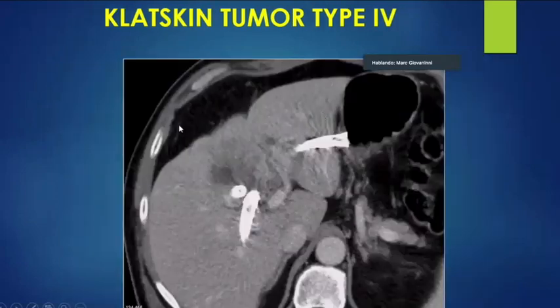And this is the final drainage of this huge and complex Klatskin tumor with 4 stents, 1, 2, 3, and 4, with a complete drainage. And this is very important to achieve a complete drainage. You will see in the recent paper that we published in 2019 that the complete drainage is associated with a longer survival time of the patient, and also if you treat this patient by chemotherapy or radiochemotherapy, if you leave a part of the liver not drained, this can induce cholangitis or hepatic abscess during the treatment.